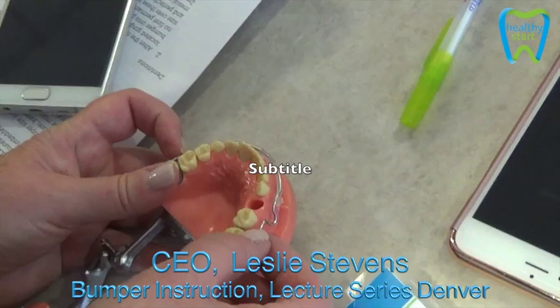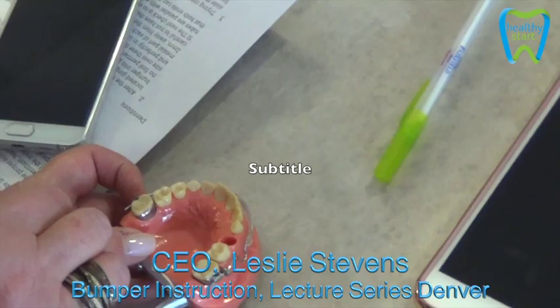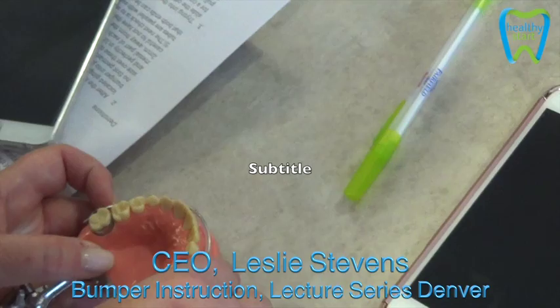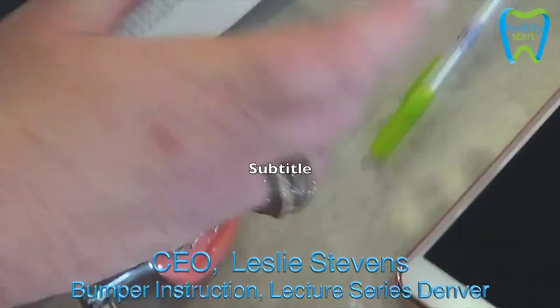So you're putting these two locks. Then the lip is going to push this back, which is going to distalize those molars. Then when they come back in a month, this lip bumper should be relatively close. So then you're going to loosen the Gurren Locks, move this forward, and slide the Gurren Locks back and tighten them up, so they're going to be stable in that position. Next month, you're going to do the same thing.